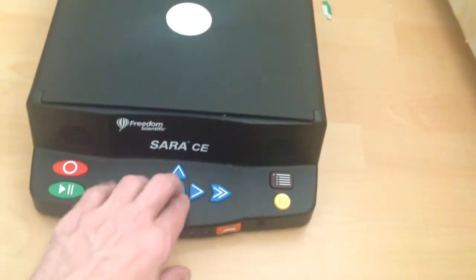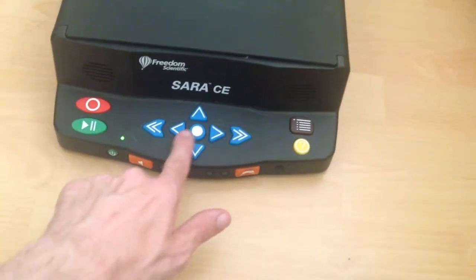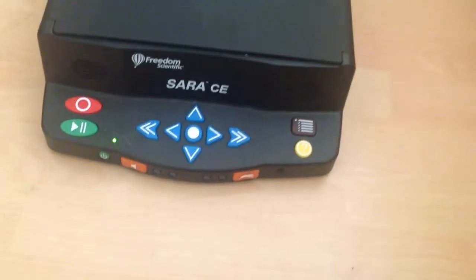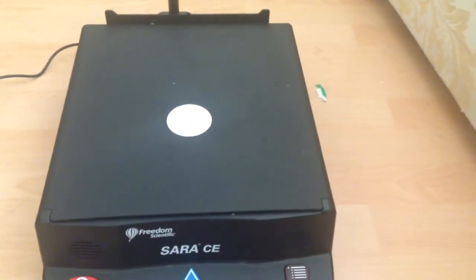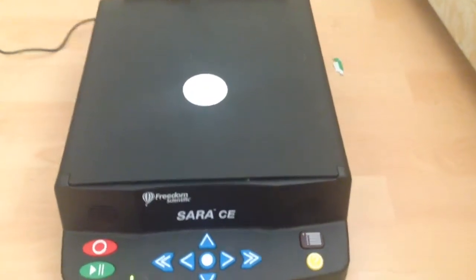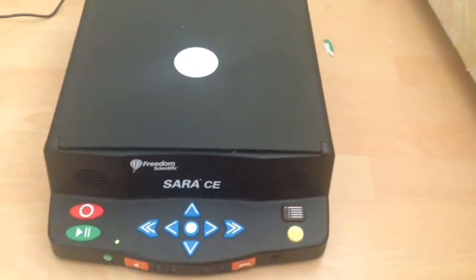Going into About SARA via the menu: SARA TN version 10.2.1030. That tells me it's a fairly new version. The copyright information reads: Copyright 2013 by Freedom Scientific BLV Group LLC — so it's a 2013 model. To exit the menus, just press the menu button again.